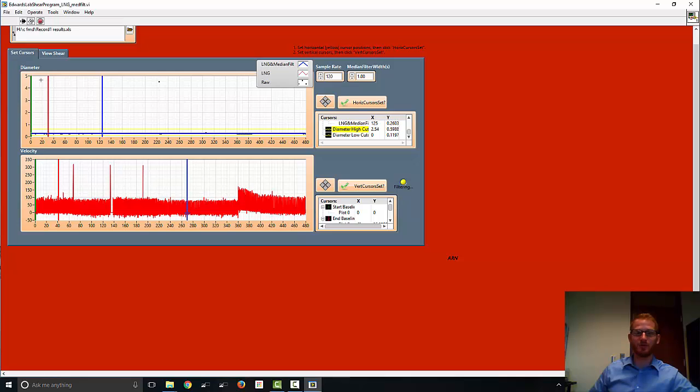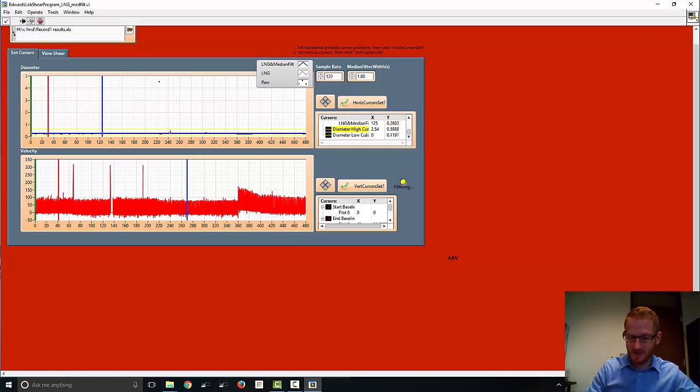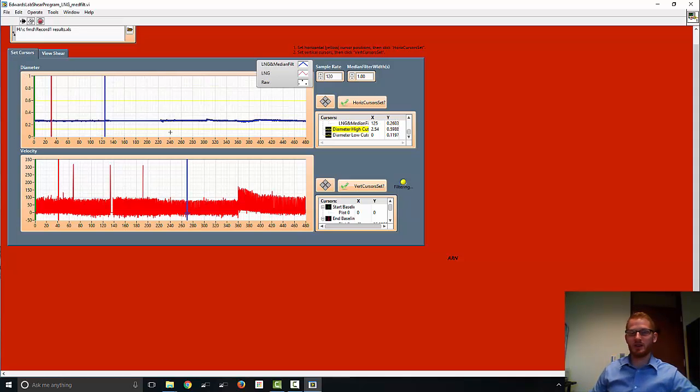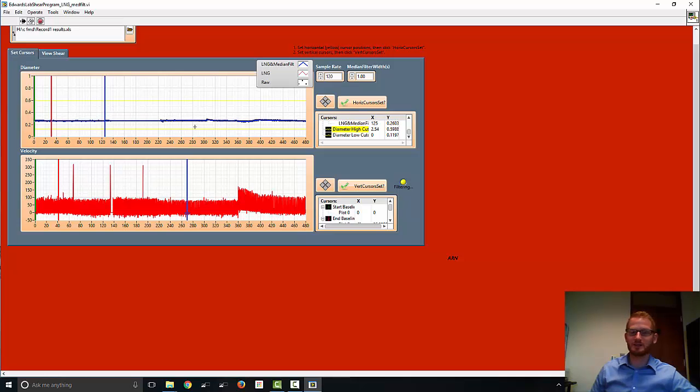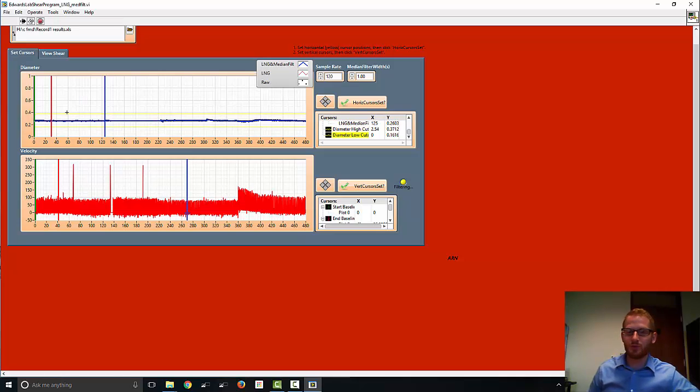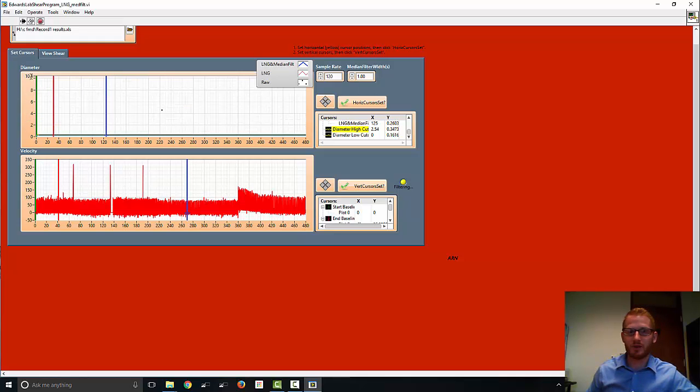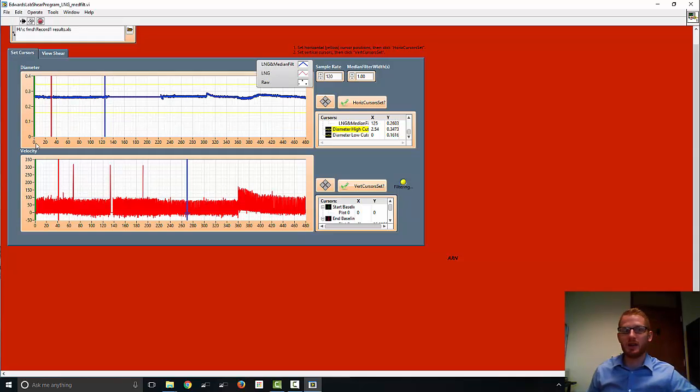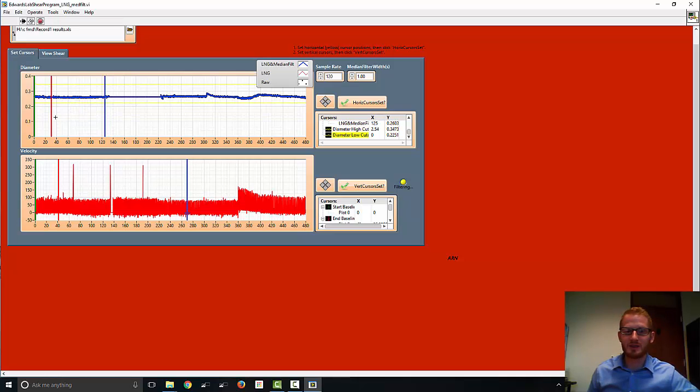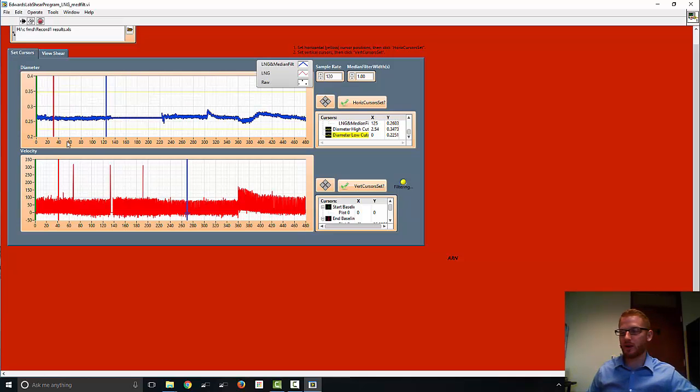So once you cut those out and it's drawing just the good data points, you can't really see much. So what I recommend doing is coming over to this scale here. And you can do this for any of the scales. Again, this is a LabVIEW program, so you can do it for any of these LabVIEW programs. So you can right click the scale, turn off the auto scale function, and now you can just type in whatever you want the scale to be. So let's just take one for now. So hit one, hit enter, and now it's starting to look a little bit more like something. It's still probably a little too big. Let's bring down this yellow line, just so we don't lose them when we shrink in our scale. So let's make the top of the scale 0.4, because I don't have any good data that's above that. And we can do the same thing down here. Let's make this 0.2.